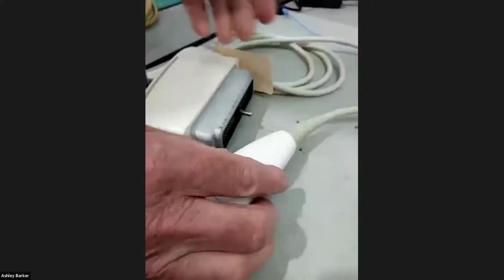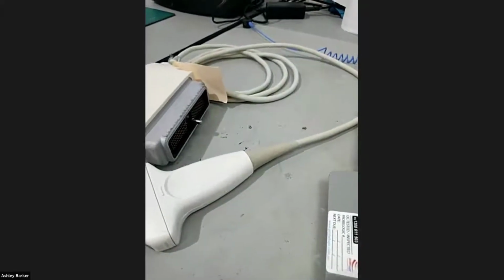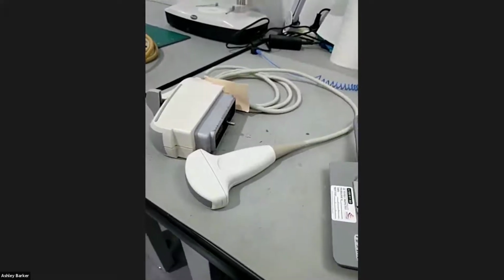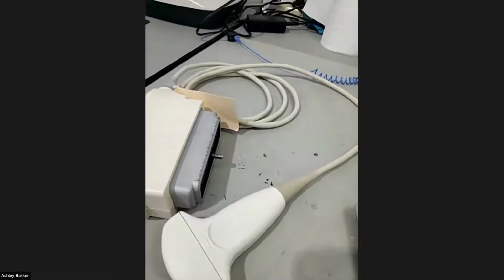That is super common. And again, worth dealing with because it's going to fill with sludge, particularly on probes that are used, you know, like transvaginal probes and things like that. You really don't want them full of nastiness. It's just not pleasant.